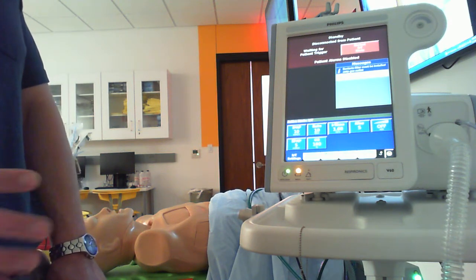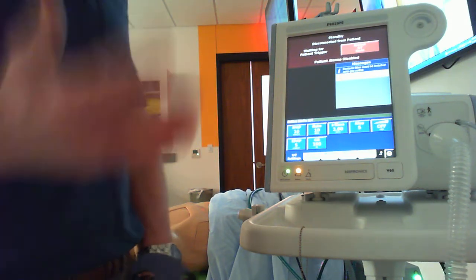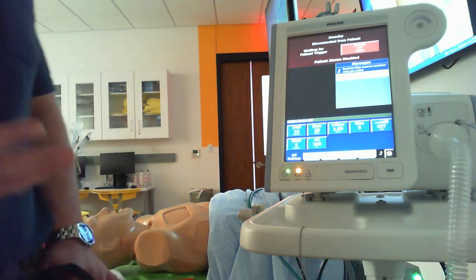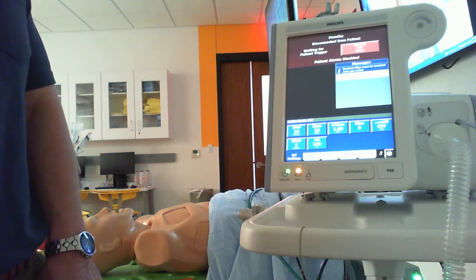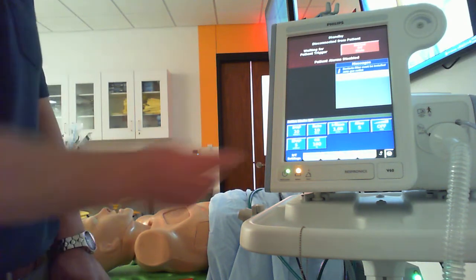If we had somebody whose saturation's okay on a non-rebreather, but they're just going on BiPAP for work of breathing issues, or to transition, we think they got a decent amount of shunting going on, we could consider that FiO2 on a non-rebreather like 60 to 80%, and we could maybe use 80 or 60 as a starting point and go from there.